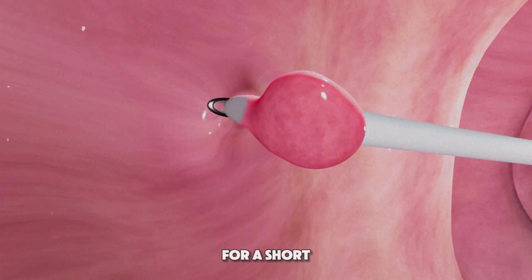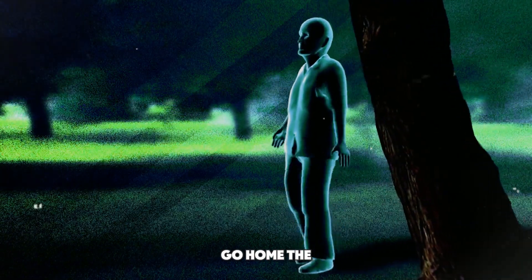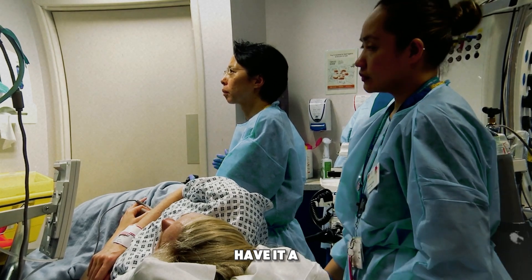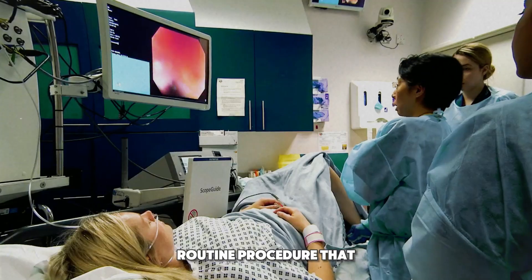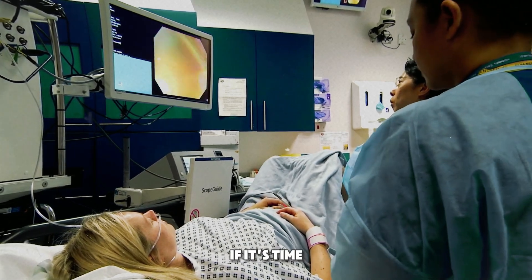Afterward, you'll rest for a short time until the sedative wears off. Most people can go home the same day and resume normal activities soon after. There you have it — a quick, routine procedure that can help keep you healthy. Be sure to consult your doctor if it's time for your screening.